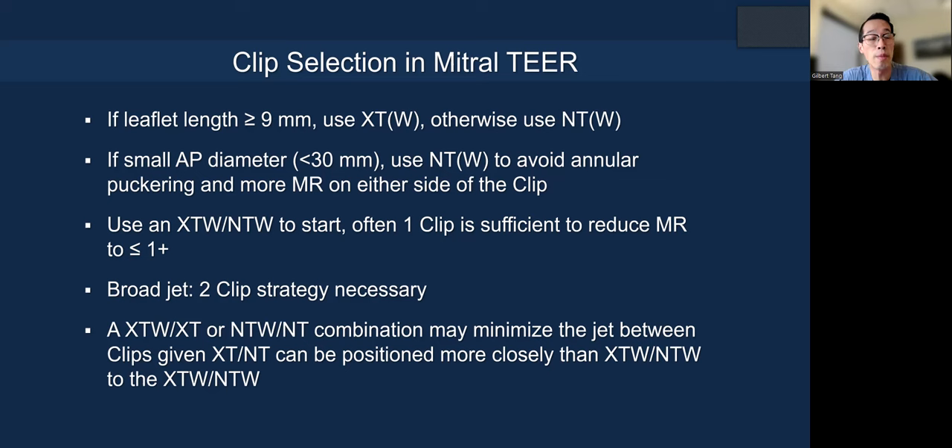The AP dimension is very important. If the AP dimension is short, you need to use a smaller clip. If you use a longer clip and improve leaflet coaptation, you might inadvertently pucker the annulus — the center part, say A2P2, gets pulled in and the MR jet actually comes from either side. You want to maintain a D-shaped annulus. So you use a smaller clip: less puckering, but you still get the MR reduction you want.